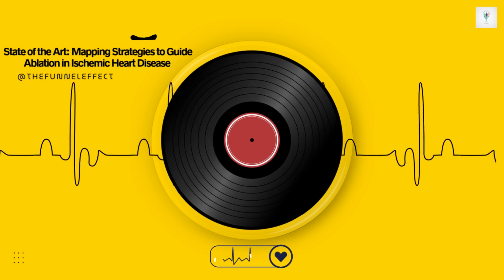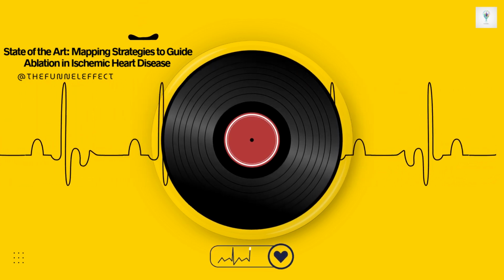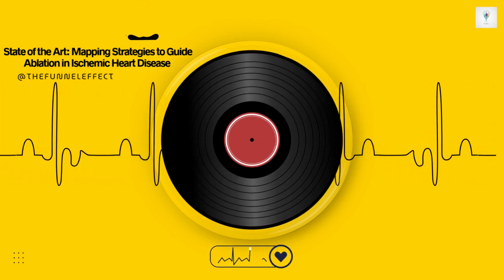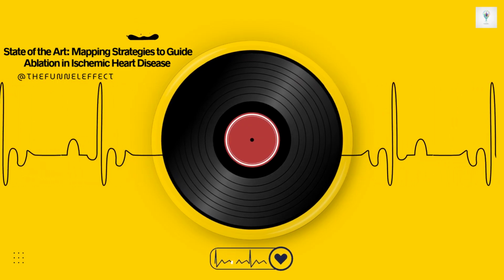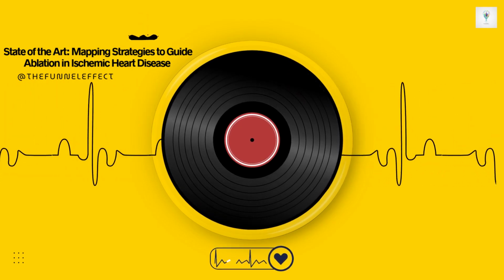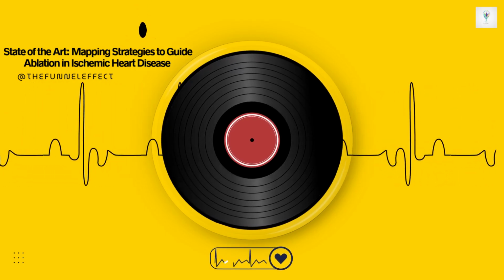Okay, so PPI matching VTCL gets you in the circuit. But how do you pinpoint the most critical part, the narrow isthmus itself, and not just some outer loop or entrance area? That requires finding the absolute hallmark of isthmus pacing, entrainment with concealed fusion, ECF. This is where things get really specific.